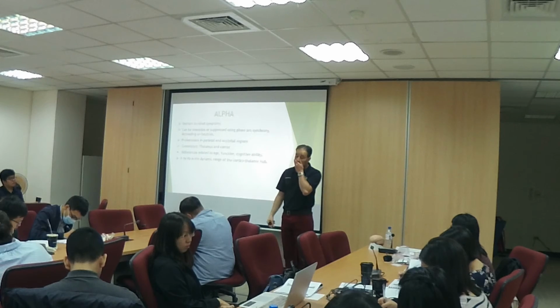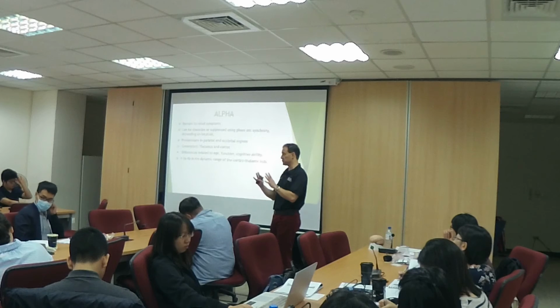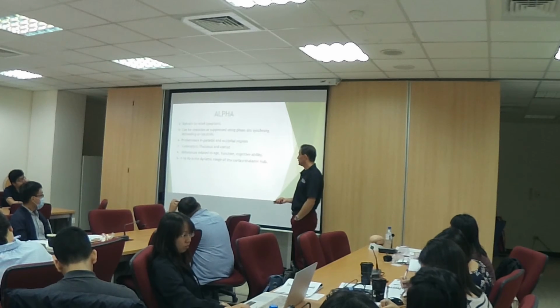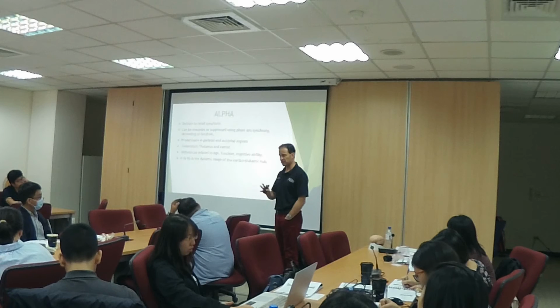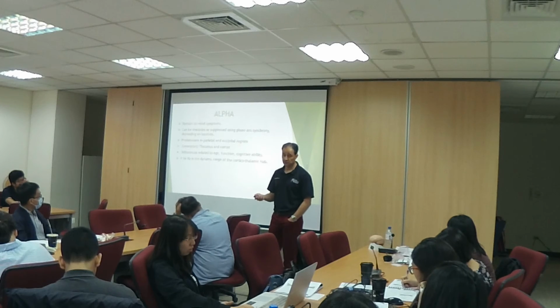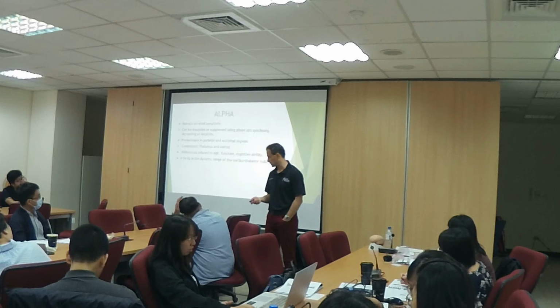You have to look at different things. I remember I had a lady last year, she's 50 years old, so she's a young woman, and her peak alpha frequency was like 8 hertz or 7 something, very, very slow. When I sent her to the functional medicine doctor and they did all the testing, it turns out she had lead poisoning.